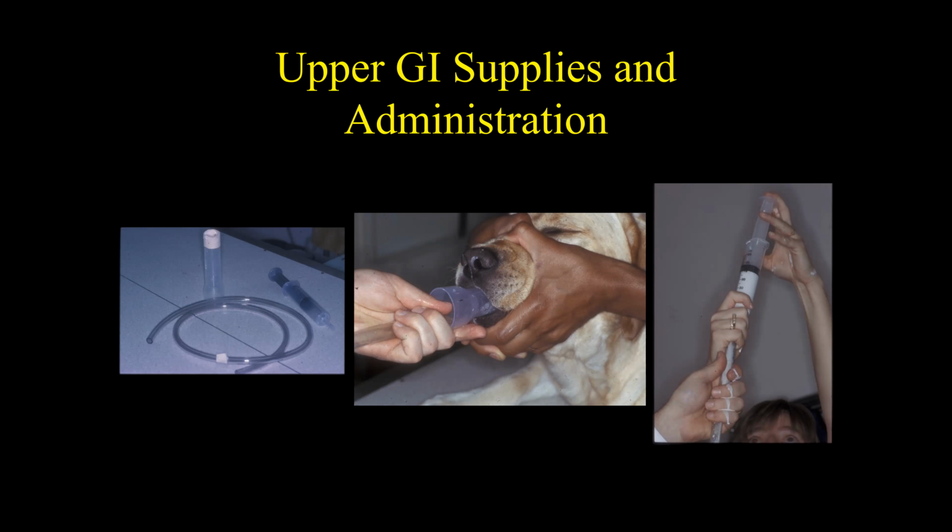Okay. So the first thing you do when you get ready to administer the stomach tube and administer the barium is you take the tube that you're going to use and, on the outside of the dog, okay, you don't pass it into the esophagus, but on the outside of the dog, you measure the length of the tube from the mid-abdomen where the stomach is, and you measure the length of it up to the tip of the nose, and then you put a little marker on the tube. That's what that piece of tape is, okay? So you can use the piece of tape, you can at least use a little Sharpie pen, and you mark the tube.